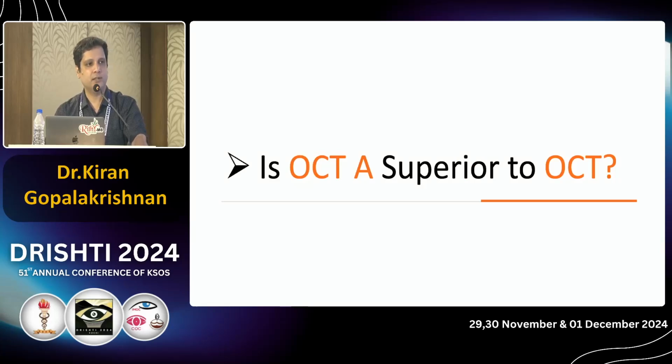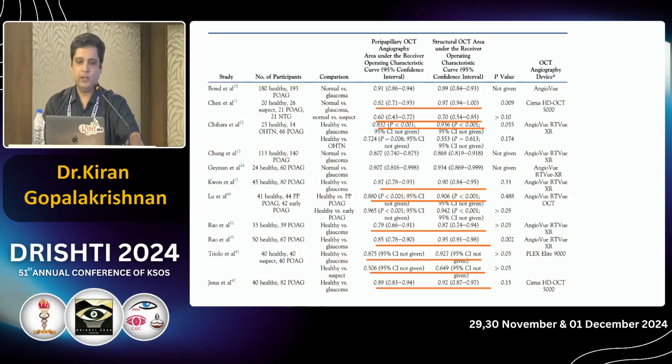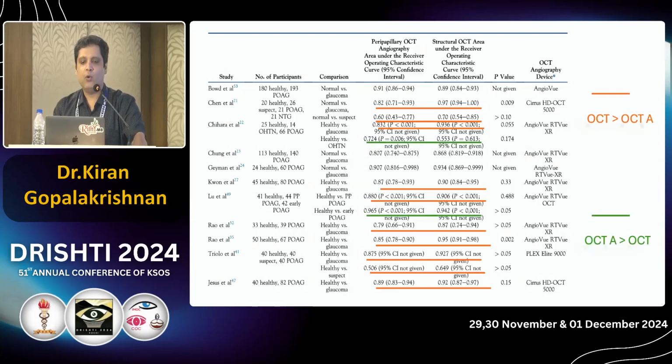The question is, is OCTA superior to OCT? Can it give you some information earlier than your structural OCT? This is not really established at all, and that is why I put a couple of question marks there. This study actually looked at the comparison between OCTA and OCT. All the studies I have marked with orange show that your traditional OCT is superior to OCTA in glaucoma, and only a couple of studies show a contradictory result where OCTA was superior.